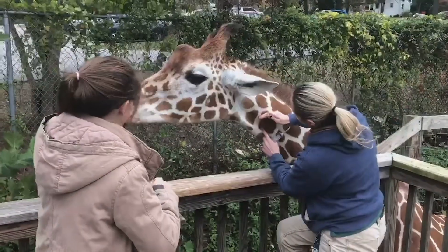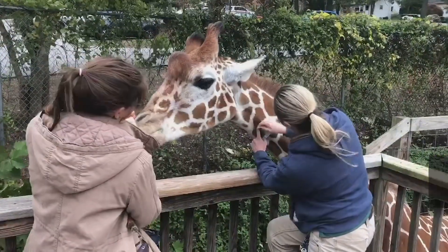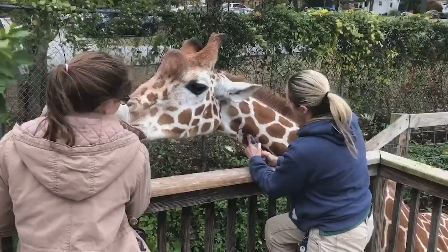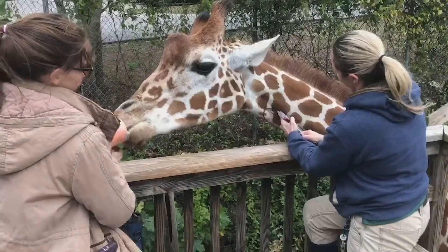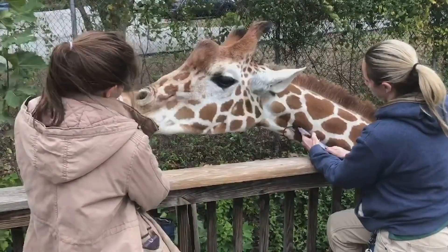Now you will see Courtney working with keeper Caroline to obtain a blood sample from Daruba, one of the Elmwood Park Zoo's giraffes. Through voluntary training, Daruba has been conditioned to allow a blood sample to be collected from his neck without the need for restraint and sedation.